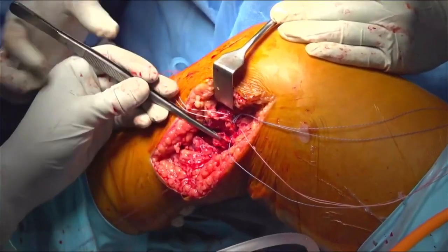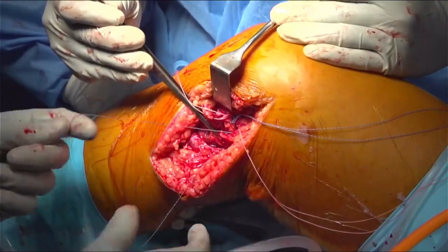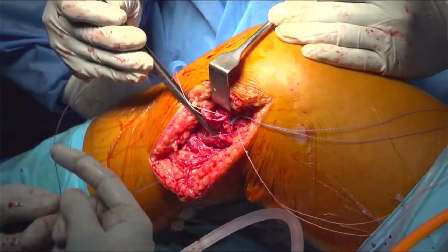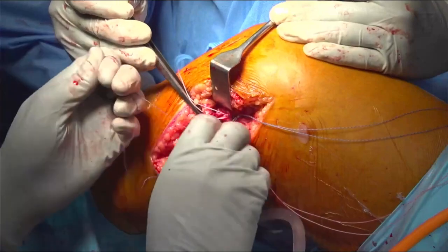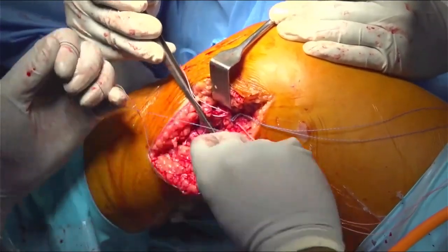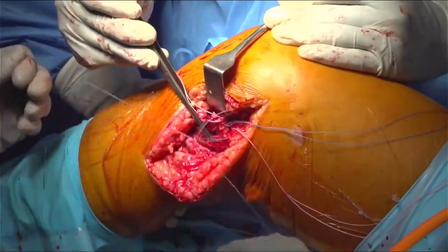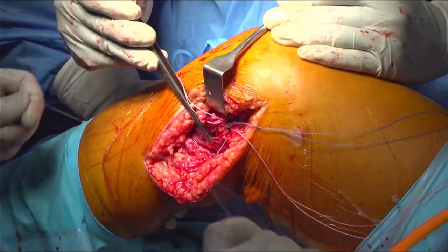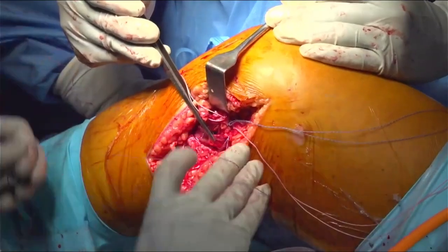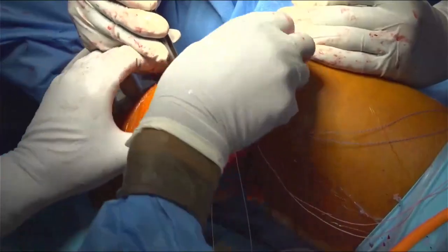Hold this please. Pull it please. So, and this is the last part which are tying. So this is a posterior medial capsule basically, which has been tying nicely. So LR anchor please now. So we are almost done with our repairs. All the 4 things have been placed into its place.